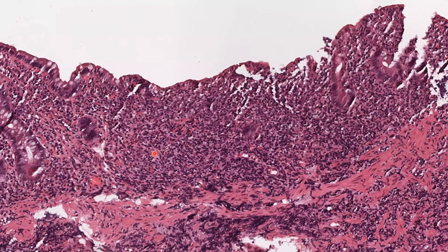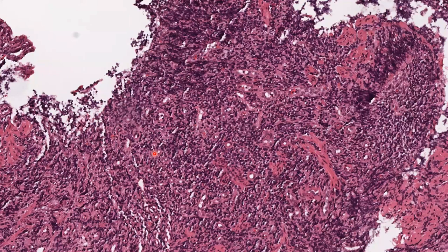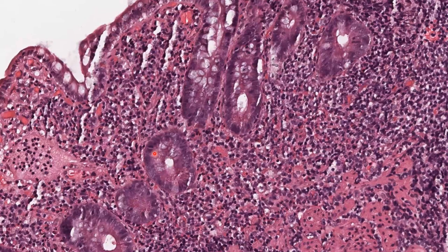You have crypt shortening, you have crypt loss, you have expansion with only inflammation, but still it is not part of your diagnosis, and you cannot make that diagnosis, okay? If you only have this in all of the biopsies, you might call it an inflammatory pseudopolyp, for example, if the rest of your biopsies are normal. But again, pseudopolyps are common with UC, but they are not a feature that you will be able to rely on to give us this diagnosis.